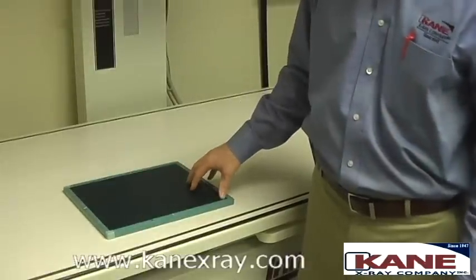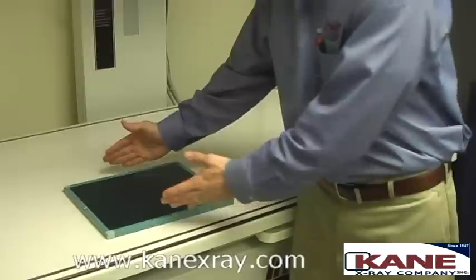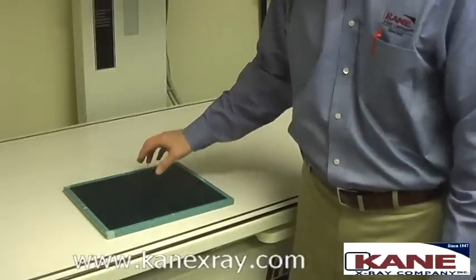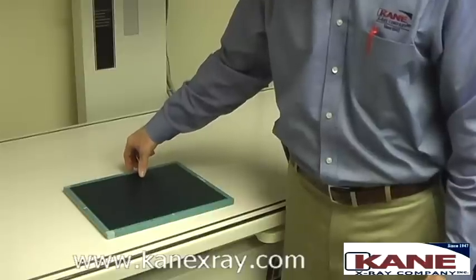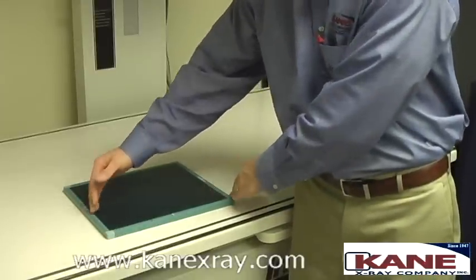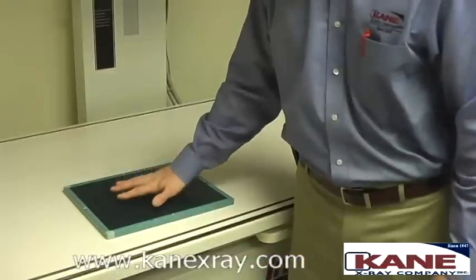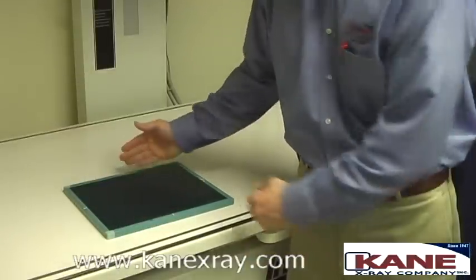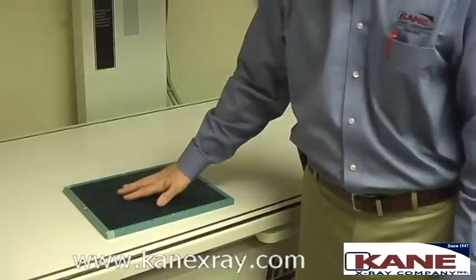When using the cassettes for exams, we want to collimate down as best as possible to the anatomy that we're most interested in. The old style left-right markers that were clipped onto the cassette are no longer recommended because it forces the collimator to be opened all the way. But again, to get the best image quality, collimate down as best as possible to just the anatomy of interest.